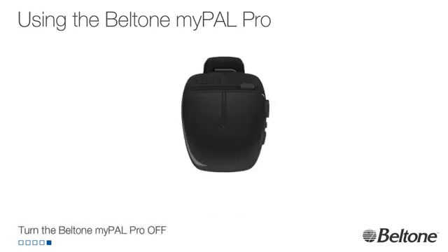Text, turn the Beltone myPAL Pro off. An arrow points to a button on the top right. Text, 1.5 seconds.